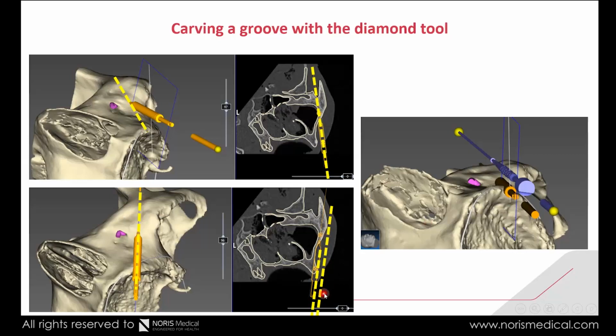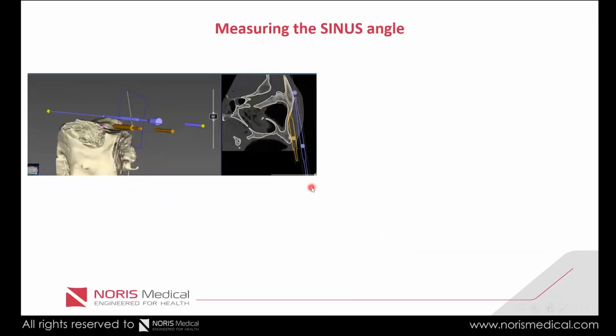And if this dimension is like the dimension that we checked before, and suppose we decided it has to be, I don't know, 2-3 millimeters, we check that. And if we are correct, that means we're on the right position. If not, we'll have to move this point, okay? Let's look how it actually looks, okay?